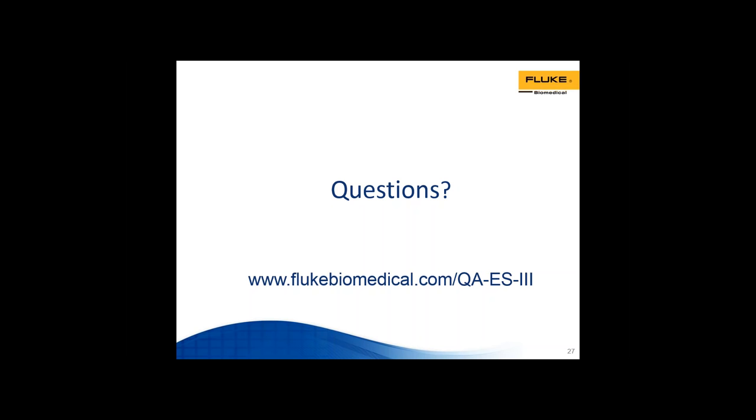Thank you. And Shireen, what is the difference between the onboard automation and optional automation that you mentioned on the QAES3? The onboard automation is the power distribution test that I had mentioned. So we talked about it during the presentation that there are loads that you need to step through and multiple parameters that you need to document. So the QAES3 has the capability to automate that test and make the test pretty easy and swift. The optional automation is the Answer plugin that I had mentioned, which is software that you can download from the Fluke Biomedical site and you can purchase. And that software actually allows you to automate the entire analyzer, to automate QAES3 for all parameters. So you can actually perform complete preventative maintenance and control the QAES3 externally through a PC through that optional automation software.